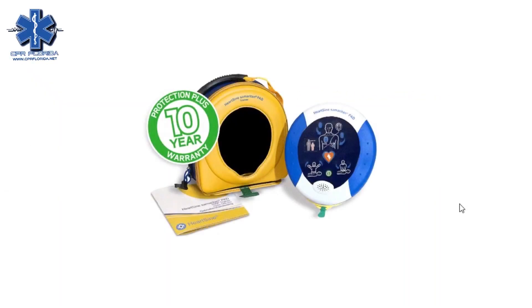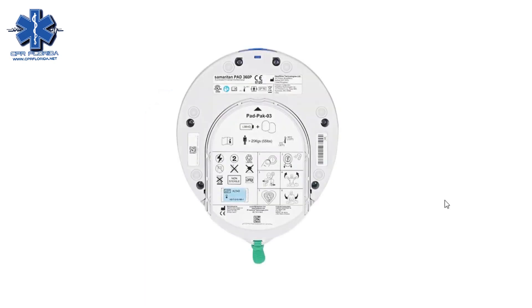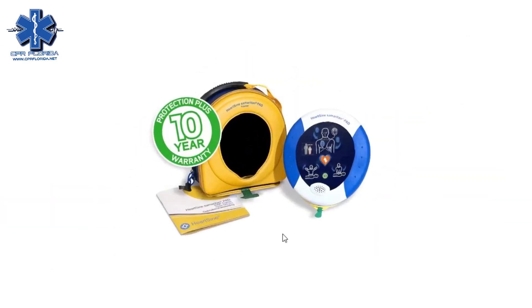The HeartSign Samaritan is one of our most popular AEDs because it has a fully automatic and semi-automatic model and also has a 10-year warranty. A unique thing about it is the child and adult pad pack — the battery and pad pack are built in, so one unit is needed instead of a separate battery and pad pack.